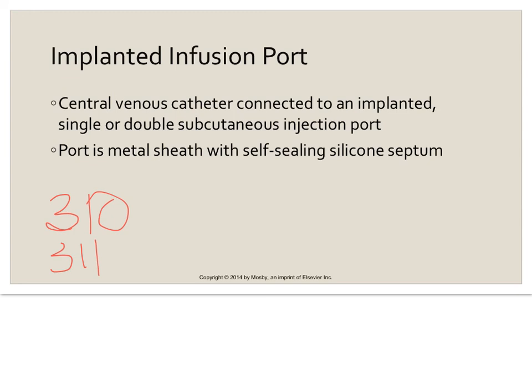It is a device that can stay in for years if taken care of properly. And the other thing that sets the implanted infusion ports apart from central lines, tunneled and non-tunneled catheters, is that it's not visible. Once the scar heals, the patient does not have any signs that they actually have a device in place, and they have no restrictions. So often infusion ports are a great option for anyone who is active, would like to be able to go ahead and swim, and not have a visible catheter.